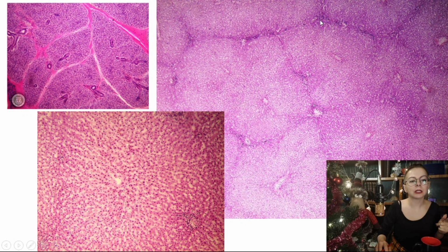And also you can distinguish here some thin-like borders between lobules. They should be hexagonal in shape, but as connective tissue is very poorly developed, then usually here no connective tissue, and lobules are not very distinctive. Only central veins and sometimes triads. Okay, so in the liver, look for the central veins. That's a helpful criterion, and also a very slight, very thin line between the lobules.